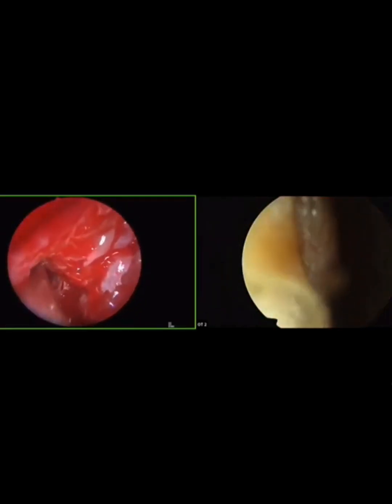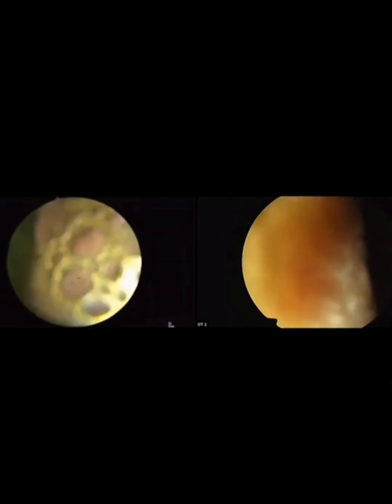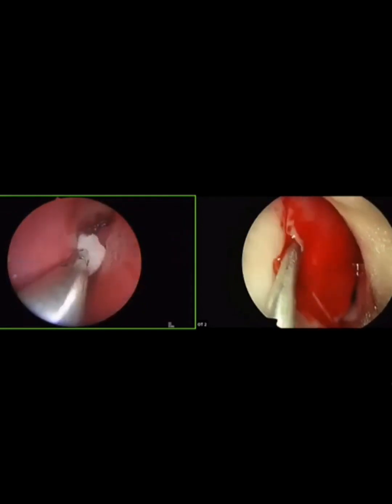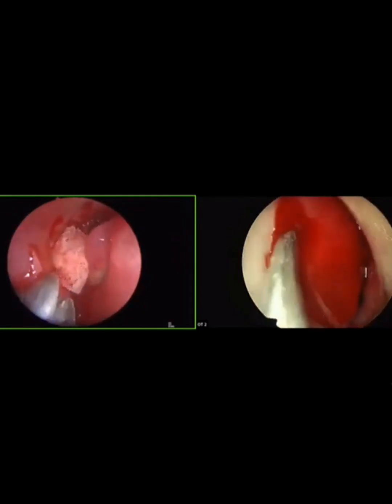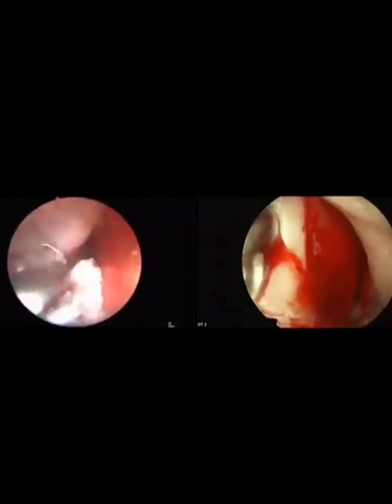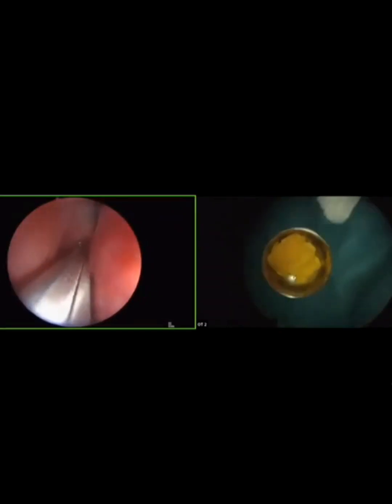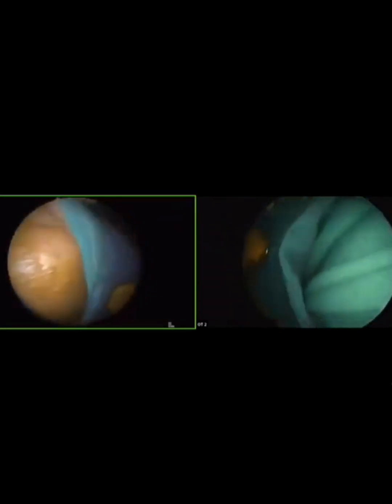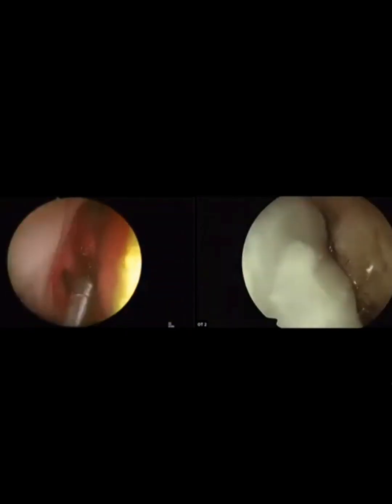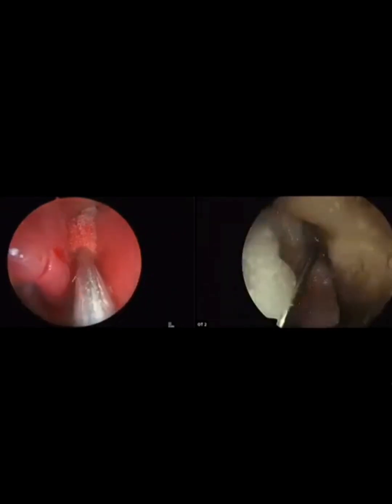Why don't you open them posteriorly, no? Posterior fontanelle. Sir, in case of huge fungal sinusitis, I only do huge mega antrostomy. Otherwise, it's okay for me, sir. No mega antrostomy in such type of disease, sir? What are the disadvantages of mega antrostomy? Only mega antrostomy in case of fungal sinusitis, sir. What are the disadvantages and advantages of the big mega antrostomy, middle meatal antrostomy?